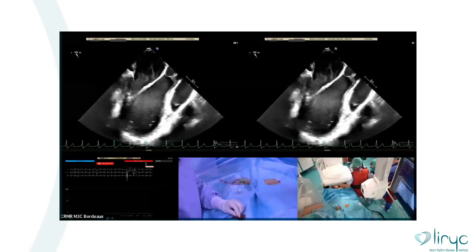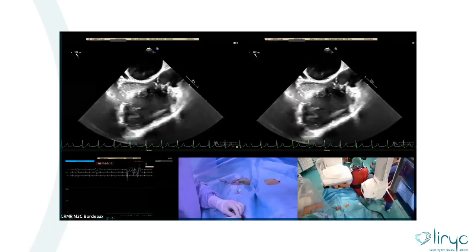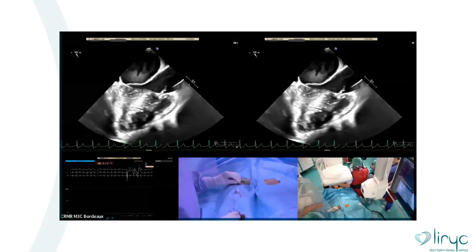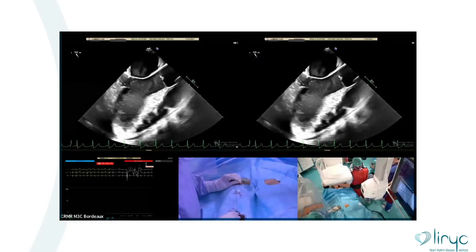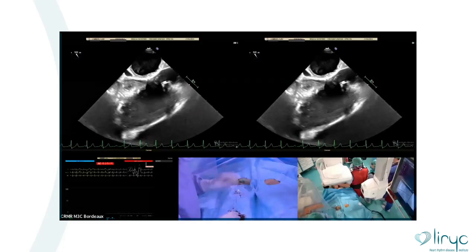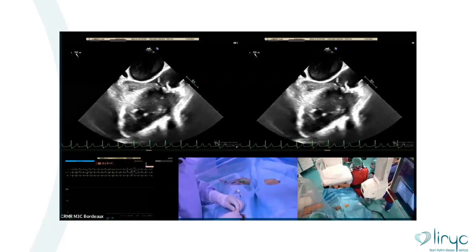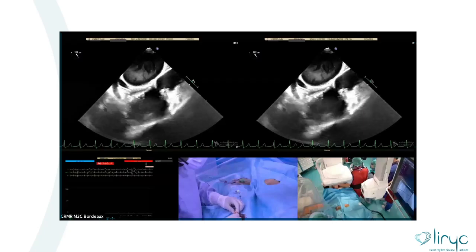Okay. Now, can you show us the long axis, Olivier? The hole is here. Okay, so please stay on. Good. So now go ahead. We're almost on contact with the shunt. Go ahead. Pousse là. Le guide.